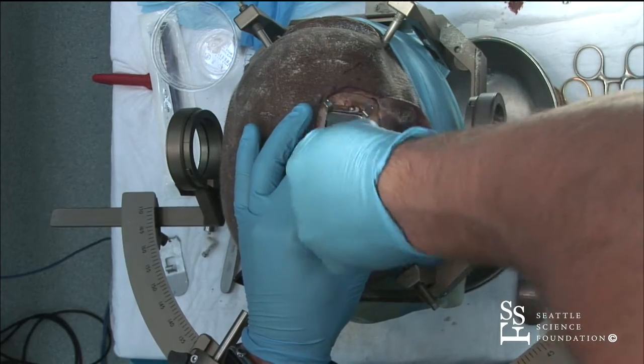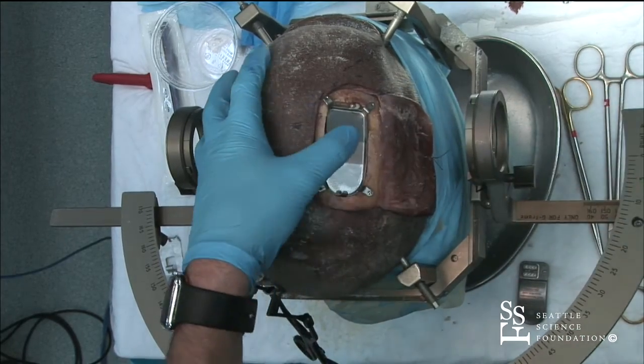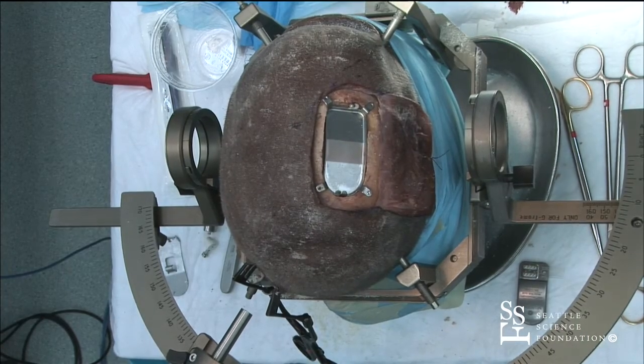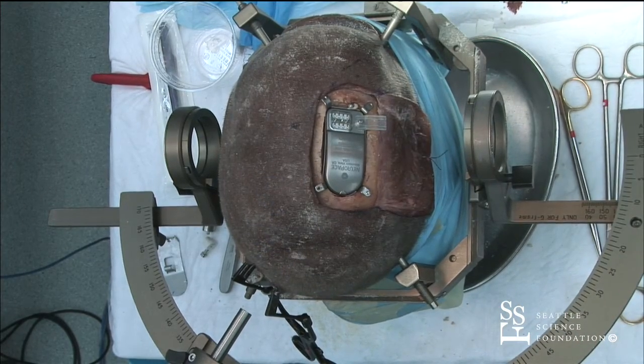And Chad, do you have a tunneling tool here or not? No? Okay. Just the straw. Okay. So put in 4 just like that, and then we'll put in the device. Do you have the torque wrench? Sorry.